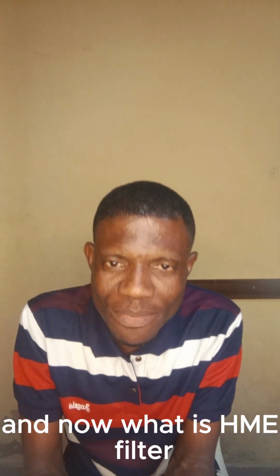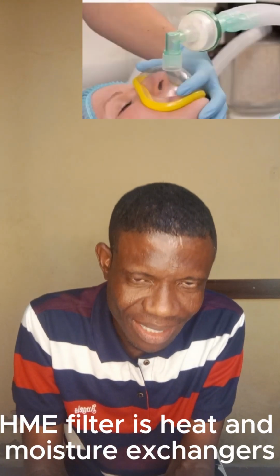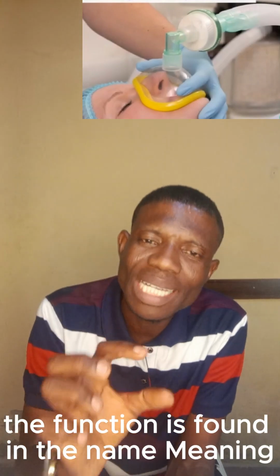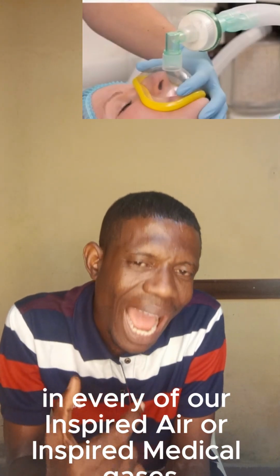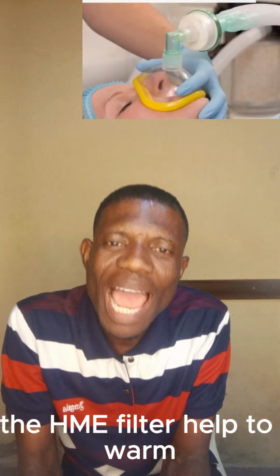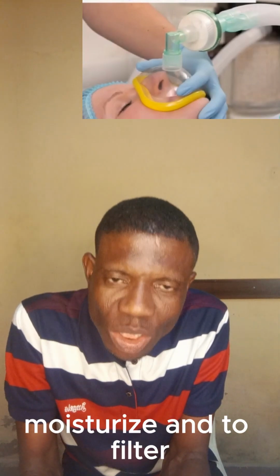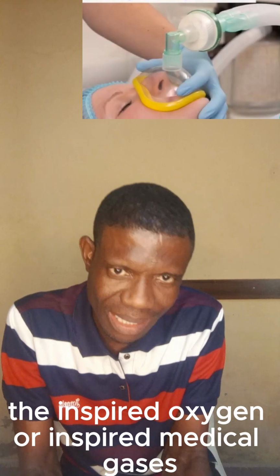Now, what is an HME filter? HME stands for heat and moisture exchanger. What is the function? The function is found in the name, meaning that for every inspired air or inspired medical gas, the HME filter helps to warm, moisturize, and filter the inspired oxygen or inspired medical gases.